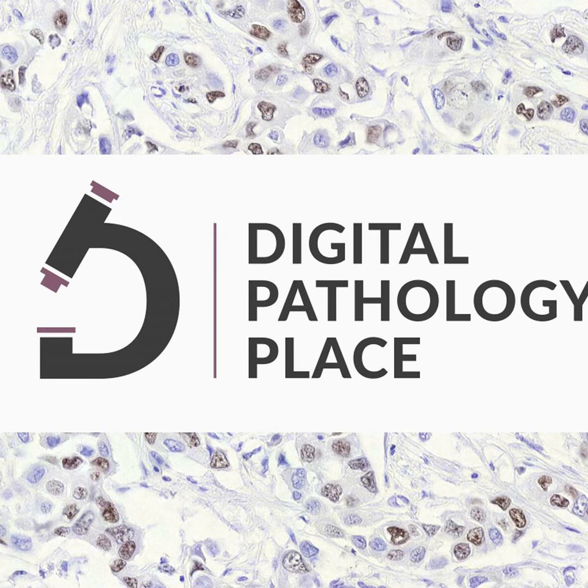It's a lot more challenging to image than anatomic pathology, where you have a super thin, nicely prepped slide. And if the histology lab knows it's going to be for digital, they're going to make it even thinner and more beautiful and all that stuff without any folds and run automated QC tools. You cannot do that with cytology. It's still not going to be flat, so you struggle with imaging, but there are devices, right?